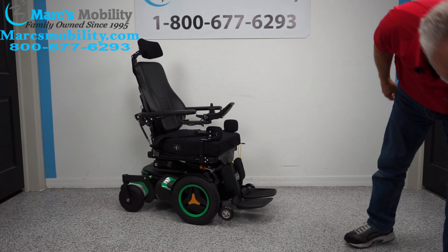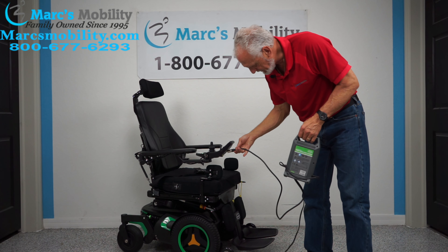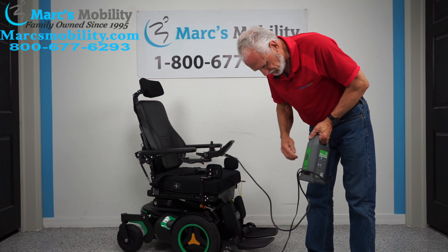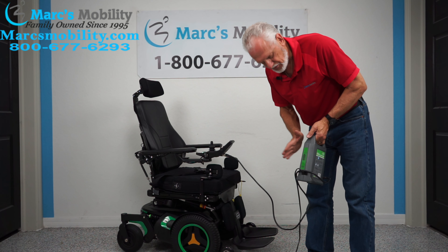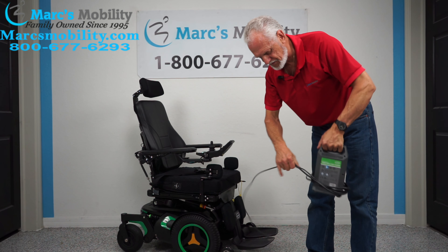When you charge the chair, you'll take your Permobil charger and plug it right below your joystick. As soon as the light goes to 100 percent, the charger will stop charging. These are smart chargers — they know when to stop.